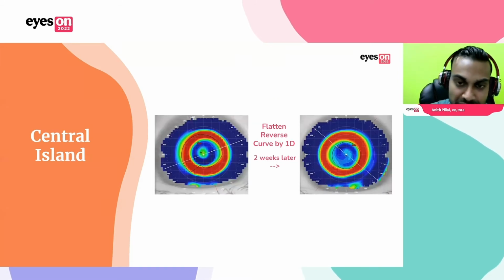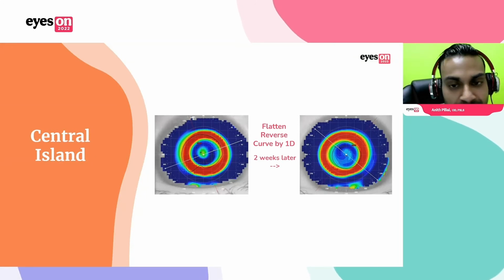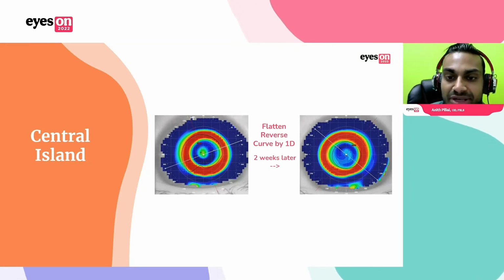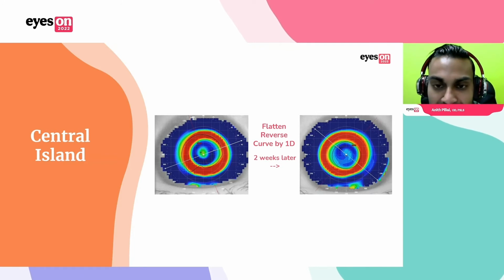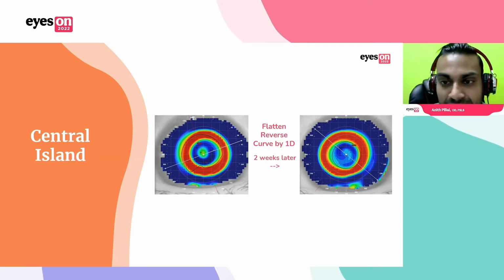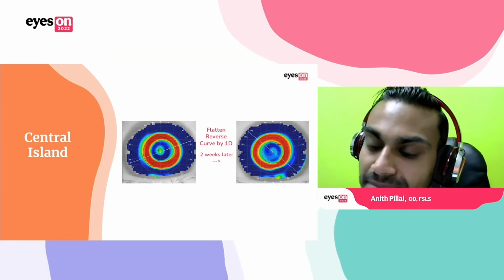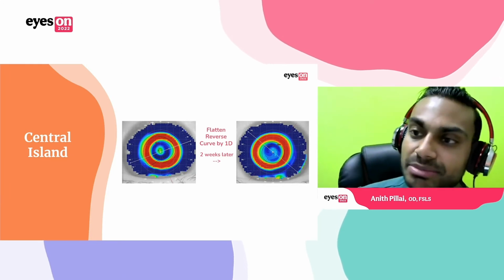And I'll show this here. This was a patient that came in and had a central island, and we picked it up right away on the topography. So rest assured, we let mom and dad know, hey, this is to be expected. We know what's going on. We just make a slight modification, flatten that reverse curve by a diopter. Two weeks later, bam, back to 20/20, and a nice center treatment.